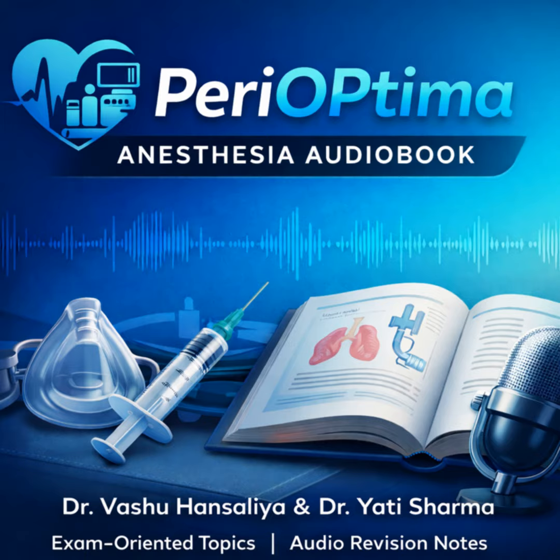And how does video laryngoscopy compare to FOI within that algorithm today? VL is now an essential component, especially for rescue or anticipated difficulty under GA. But FOI remains superior in certain highly specific situations. Such as severe cervical spine immobility and extremely limited mouth opening. A slim, flexible scope can go where even a thin VL blade can't. VL usually requires muscle relaxation, sacrificing SVA, whereas AFOI maintains that safety net.